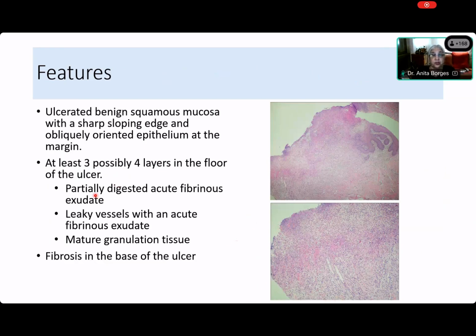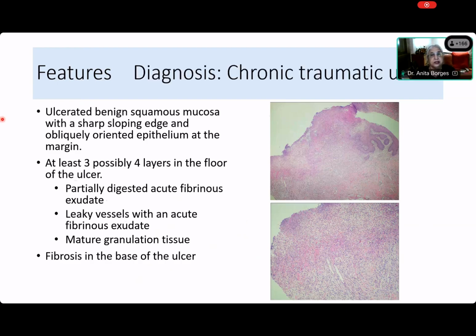Okay, so you've got the 3, maybe 4 layers: partially digested acute fibrinous exudate, then leaky vessels with an acute fibrinous exudate, then mature granulation tissue, and there is fibrosis in the base of the ulcer. So note that this is the floor of the ulcer, and the base is down here. Okay, the rest of it is all parts of this. All right. The diagnosis is that this is a chronic traumatic ulcer.